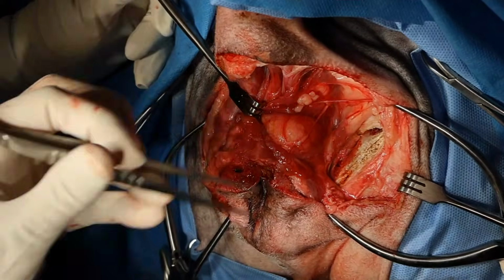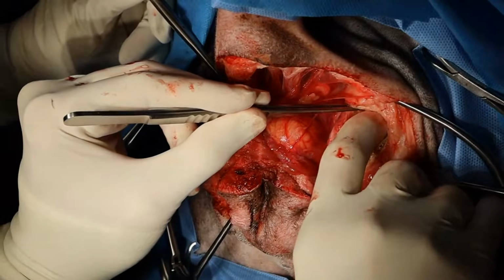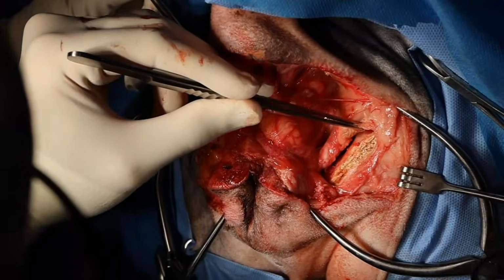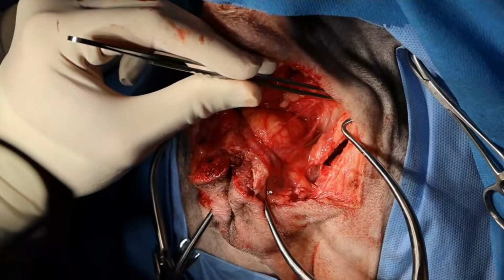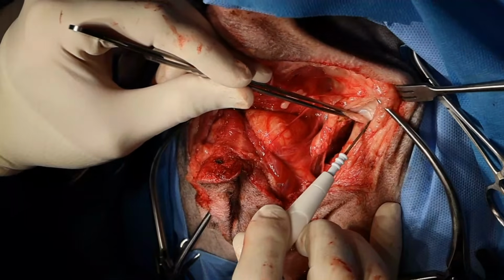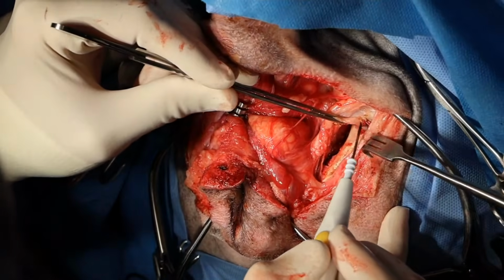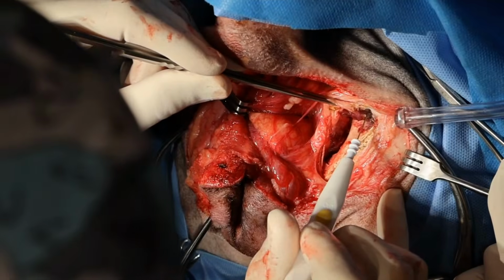That's the internal obturator that I've elevated right there. External anal sphincter, levator ani coccygeus complex. And then I'm just dissecting forward a little bit, and you can actually completely release the internal obturator from the ischiatic table. Now the sciatic nerve is right up there, so I don't use the sacrotuberous ligament unless my muscle flap fails.